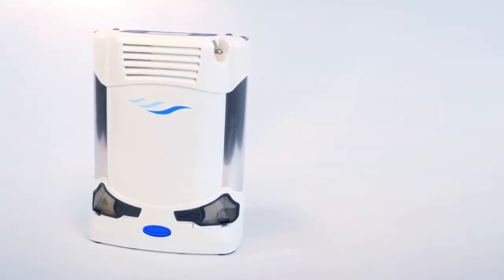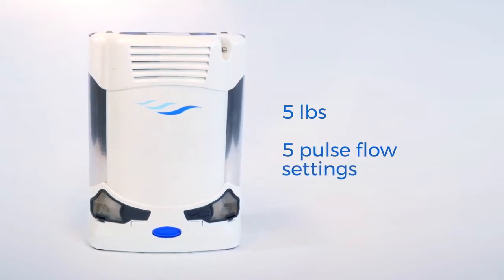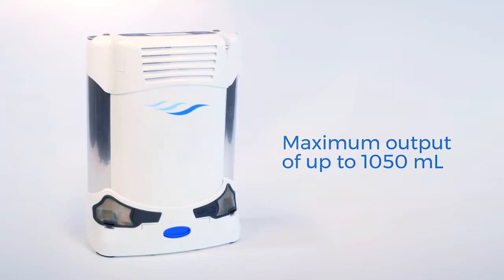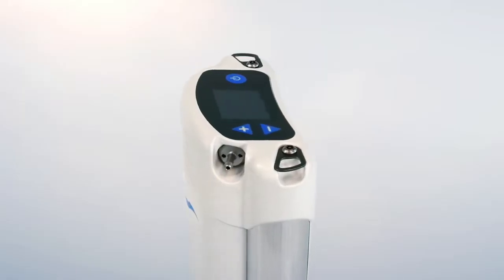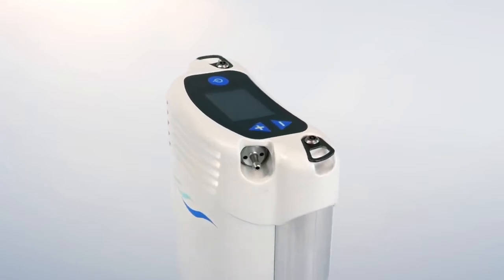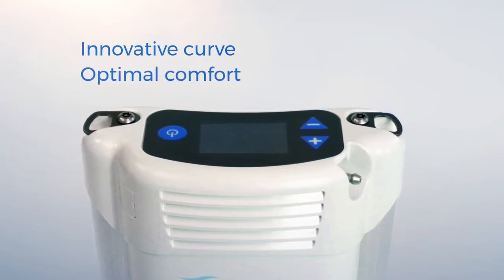The Care Freestyle Comfort is a lightweight five-setting pulse flow portable oxygen concentrator with a maximum output of up to 1,050 milliliters. Weighing only five pounds and designed with patient comfort in mind, the Freestyle Comfort's ergonomic design includes a curved shape that hugs your hip and makes it more comfortable to wear.